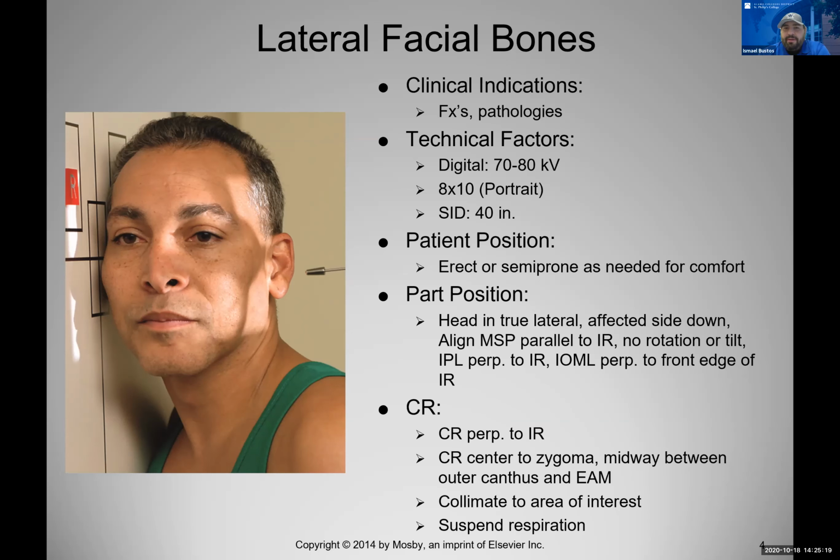Get in a true lateral. CR is going to be perpendicular to the IR, and we're going to center to the zygoma, or midway between the outer canthus and the EAM. So let me show you. Go back to this one here.